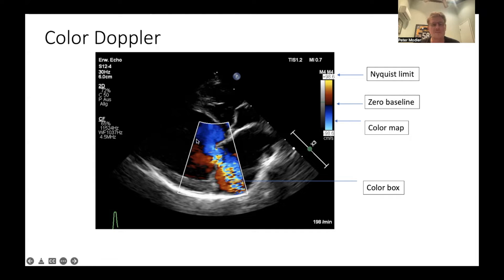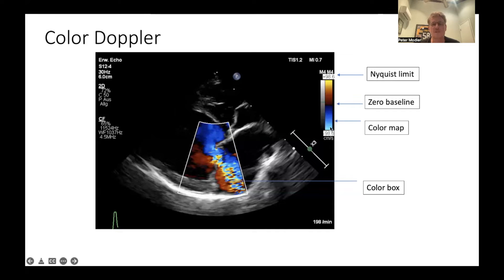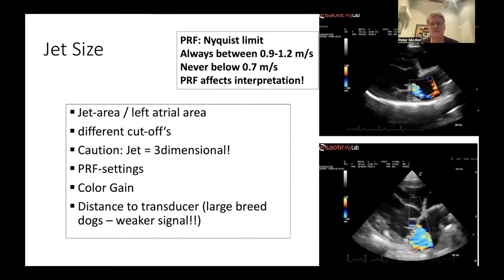This is a typical color Doppler image. What you can see is the two-dimensional grayscale image superimposed by the color Doppler within the color box — the region where blood is interrogated for velocities. On the right side of the image you see your color map. The most frequent setting on ultrasound machines is that blue means blood is flowing away from the transducer and red means blood is flowing towards the transducer, with shades of red and blue giving a semi-quantitative impression of velocity. Very important is the Nyquist limit number shown at the top and bottom — here it is set to approximately 98.6 centimeters per second.